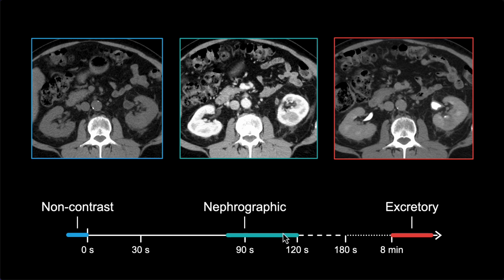One of the things to make sure that you've thought about in your own practice is that when you're encountering a CT urogram, which is going to be one of the most common studies tailored for looking at the GU tract and the kidneys, is how you're going to be approaching each series efficiently. And so I do encourage you to consider a checklist approach.